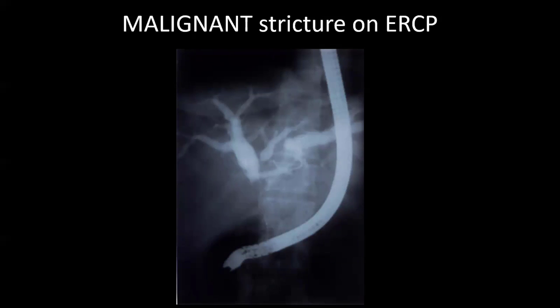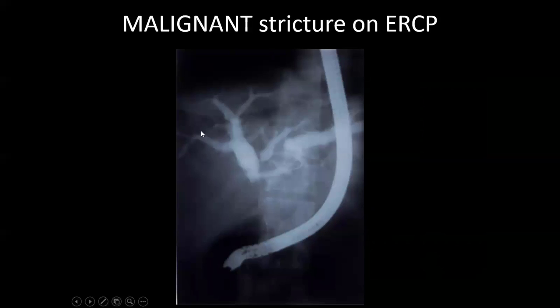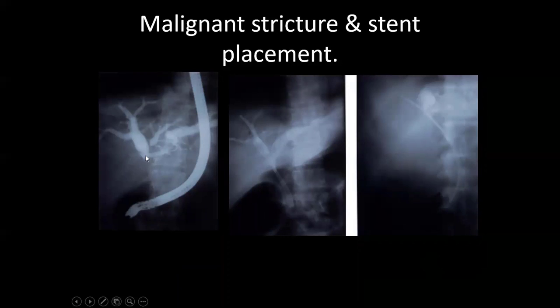Here is another example of ERCP where we can see dilated proximal CBD and there is an abrupt cutoff. This abrupt cutoff is because of a mass lesion. So we will take a biopsy from this area and remove the obstruction by passing a stent. Here you can see the obstructed portion — contrast cannot be seen in the distal portion — while after passing the stent there is free flow of contrast through this region.